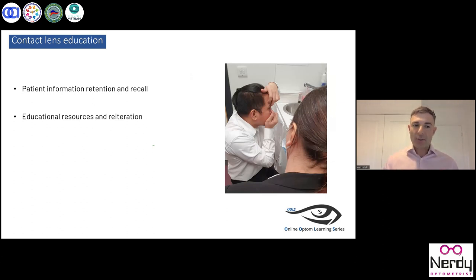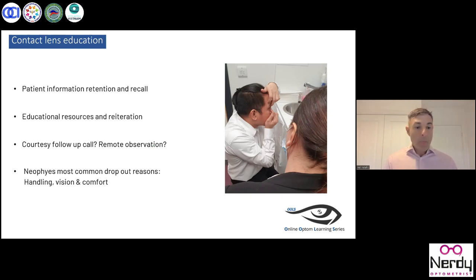We need to reiterate several times to land messages as well. So does your whole team throughout the contact lens journey say the same messages and train people in the same way? It might be worth spending some time with the rest of your team so that you have that consistent approach. It's always really useful with a new wearer to do a courtesy follow-up call within the first week of lens wear. And you can even, if they are, for example, struggling with handling, see what's happening in their own environment, check if they're washing their hands, see how they're positioning themselves in front of a mirror, and give them that extra coaching they need. Or you might be able to then recommend bringing them back in for additional training if that is needed.